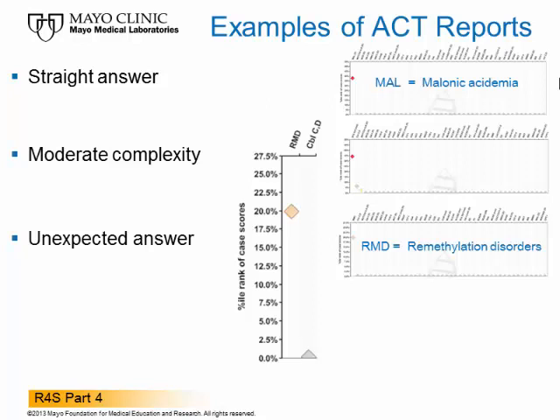It is likely that many cases like this will continue to be overlooked because many laboratories do not even have a low cutoff for this amino acid, so a result near 0 would still be considered to be normal. In the R4S database, 124 laboratories have posted a high cutoff for methionine, but only 66 of them also have indicated their use of a low cutoff value.